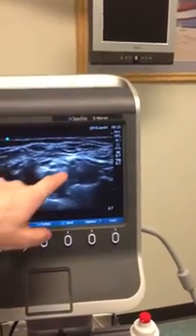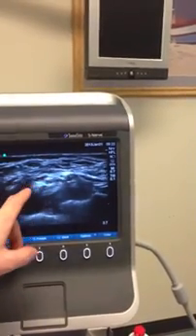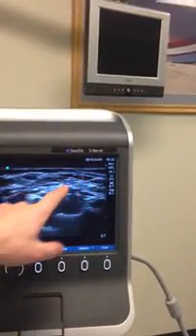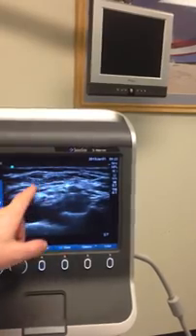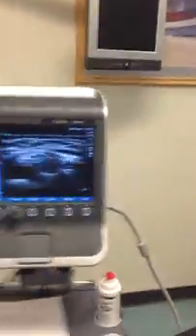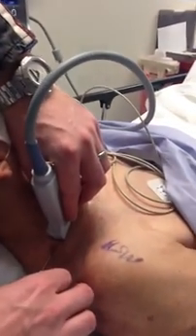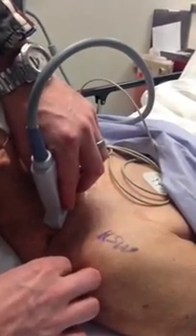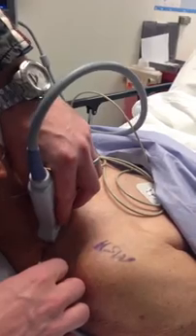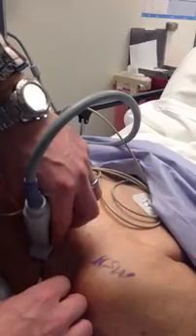This is the artery, and the upper portion of this bundle is where the axillary nerve runs. So I'm going to take my needle, place it in this direction, and deposit my medication on the top of the plexus, avoiding going underneath the plexus. You can see the angle I come in on. I start just above in the trap and I advance my needle. There's my needle.